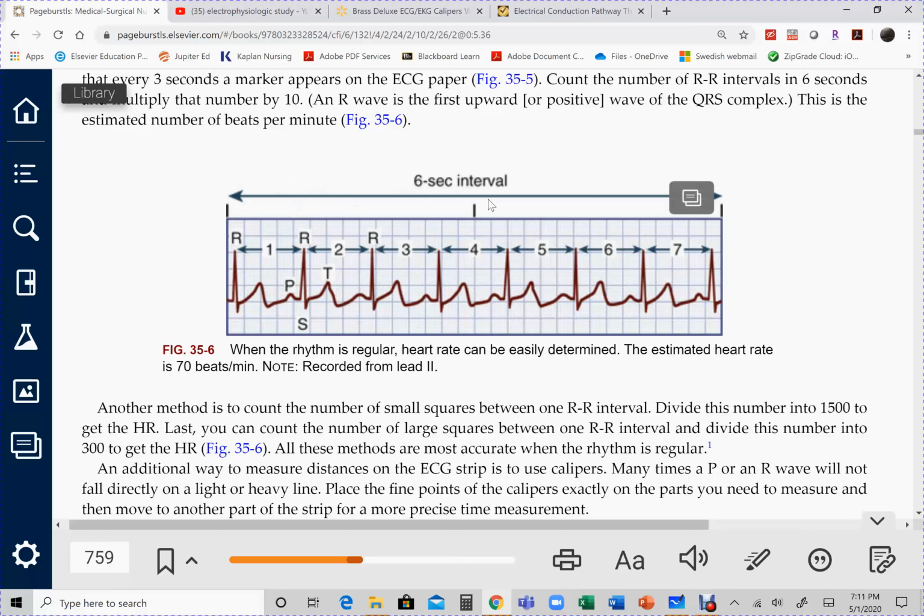So I'll go 1, 2, 3, 4, 5, 6. This one, although not complete, if you see here, this P can be moved here, because this is 6 seconds. If we move this P over here, then there would be enough room to include a T here, right?